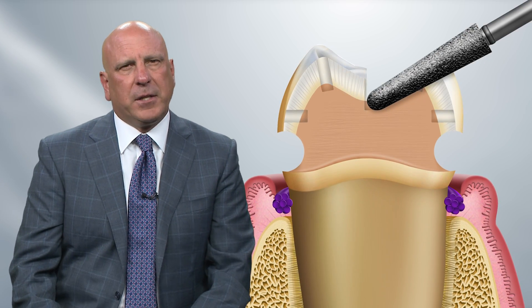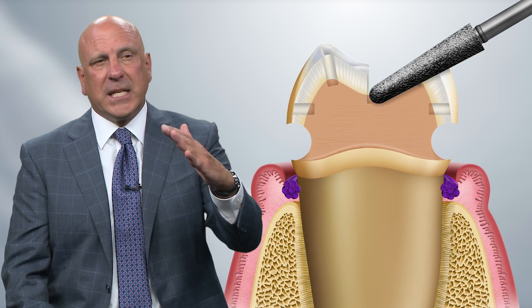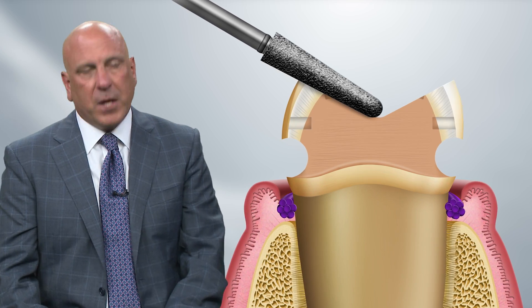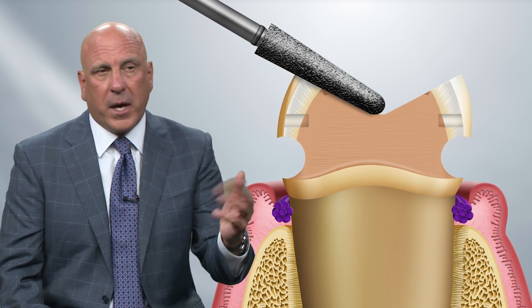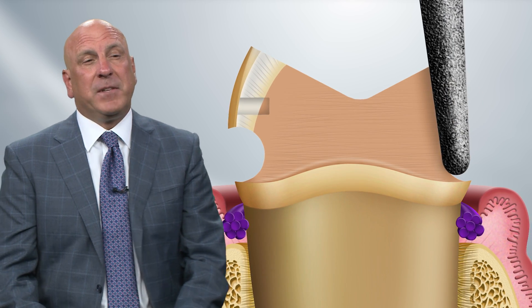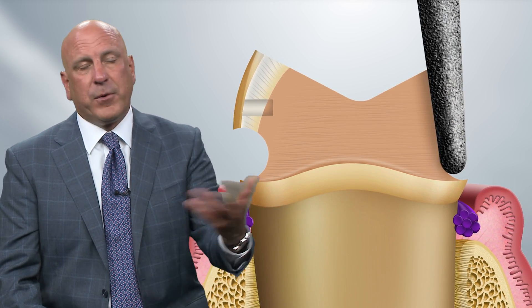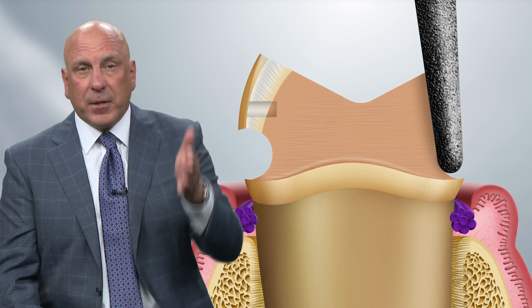Hold the 856025 burr parallel to the occlusal surface while simultaneously pushing the tip down to get to the bottom of the depth cut in the central groove. On the cusp tip, you could also use the football burr, the 379023, if you wanted to. It really doesn't matter what you use for this gross reduction — whatever works for you is fine. Then use the 856025 or maybe the 021, depending on whether we're doing solid zirconia, to prep the axial wall.